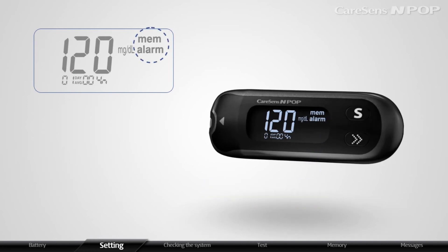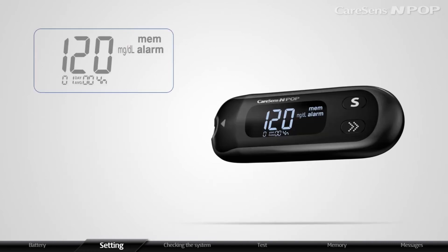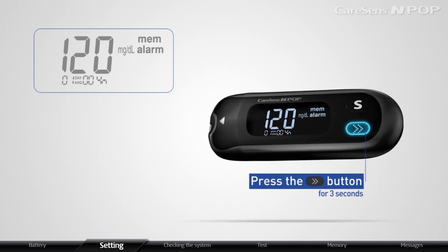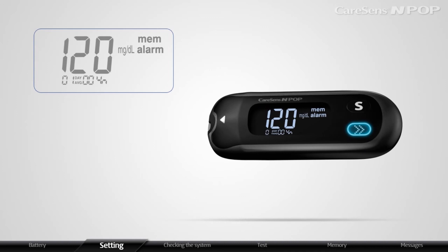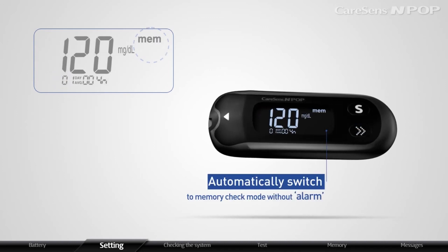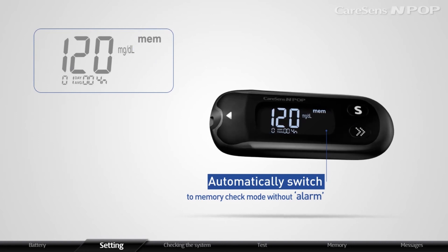The meter will display alarm if it is on. In order to turn off the PP2 alarm, press the arrow button for 3 seconds. After displaying PP2 and off, the meter will automatically switch to memory check mode without alarm.